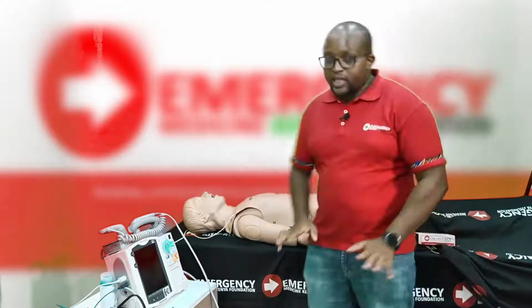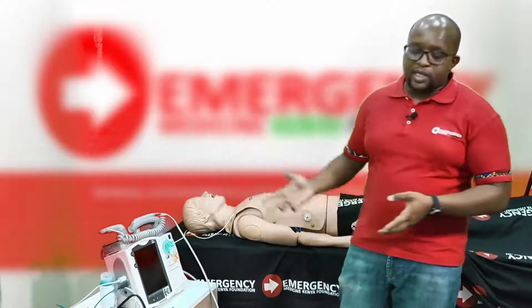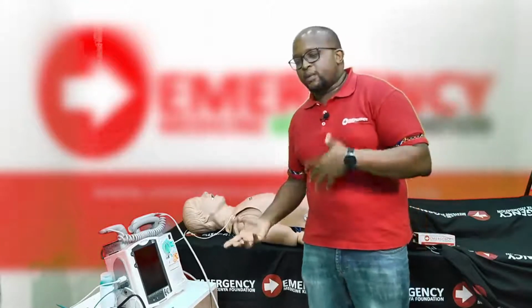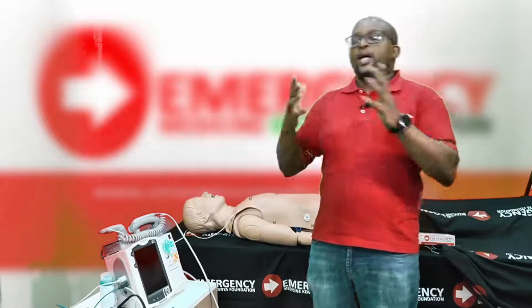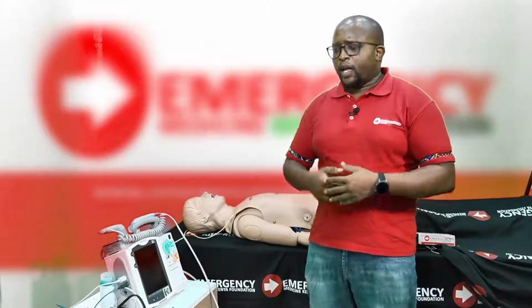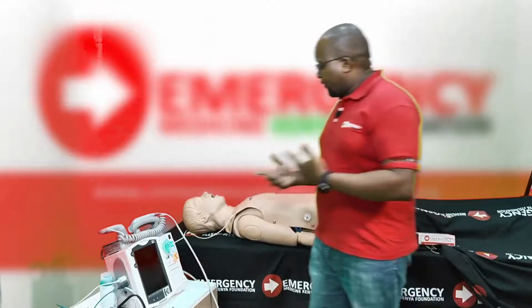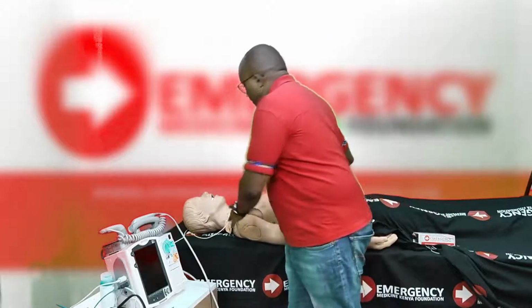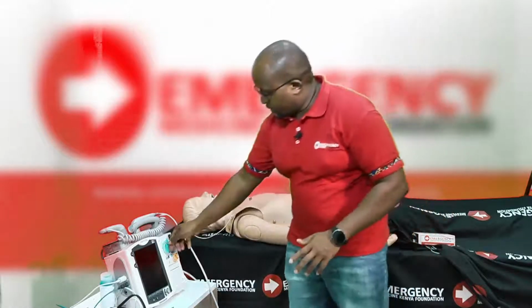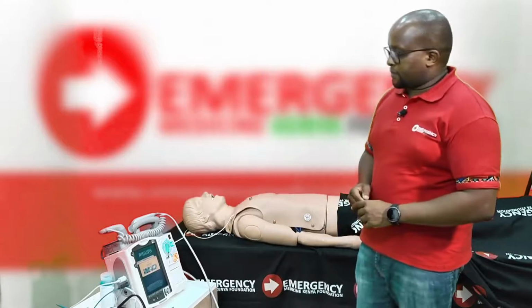So potentially what's going to happen is the patient will present to the emergency department and they'll be complaining of being a bit dizzy, a bit sweaty, a bit short of breath, and maybe a bit of chest pain. So again, your patient is talking to you, and the first thing you want to do, of course, is the moment they get in, connect them to the monitor, without any cables running over the chest, to just see what the rhythm is.